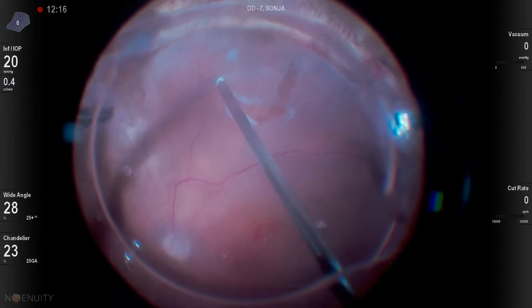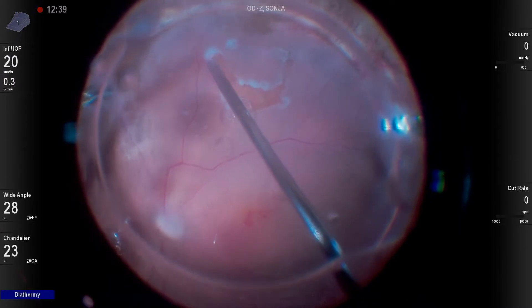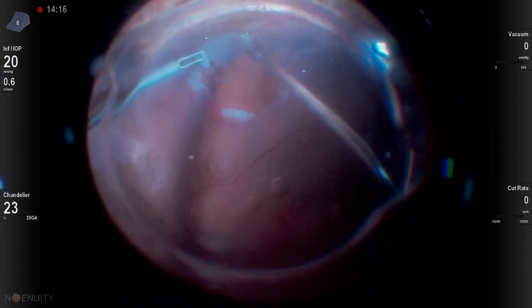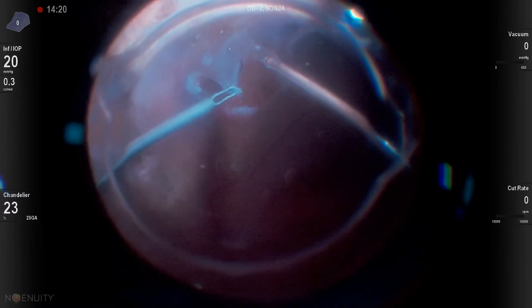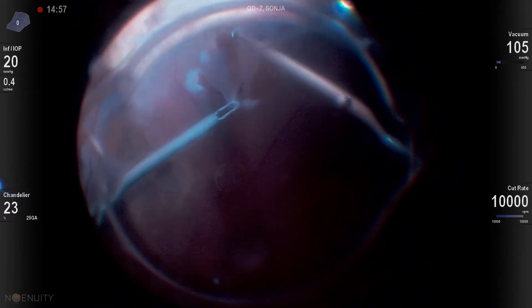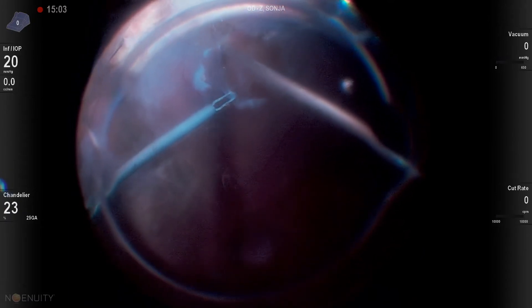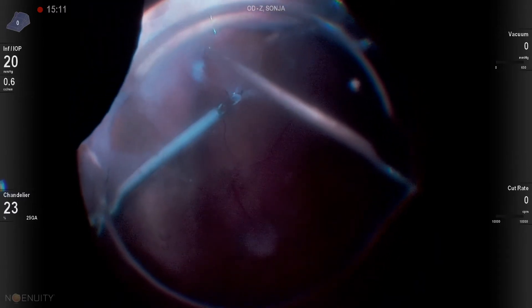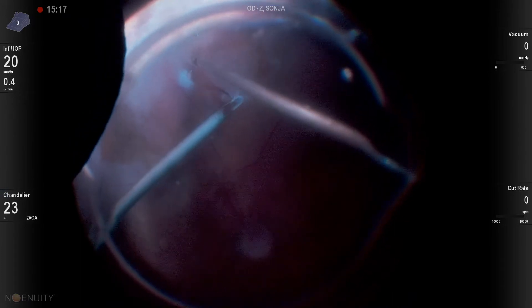Got to be very careful. A 27 gauge would probably be even better because it would be more precise. You can see I'm able to get my transplant site pretty well harvested. I go back to scissors but again can't get the right angle, so I go to my cutter and using a bimanual technique with the chandelier light in place, I'm able to create this transplant graft — you'll see the last cut here, freeze it.